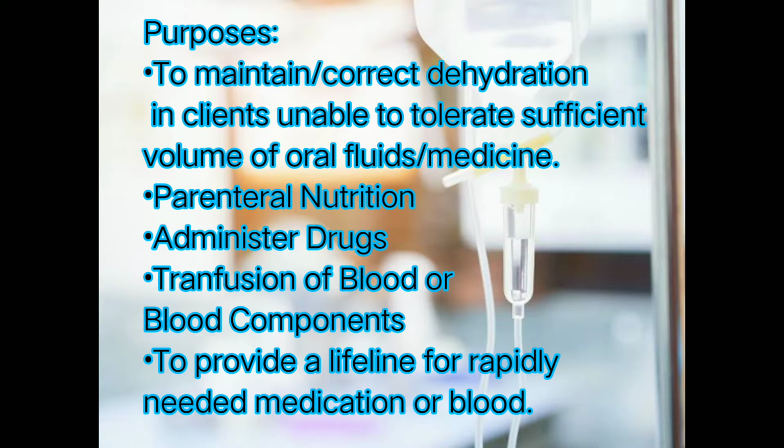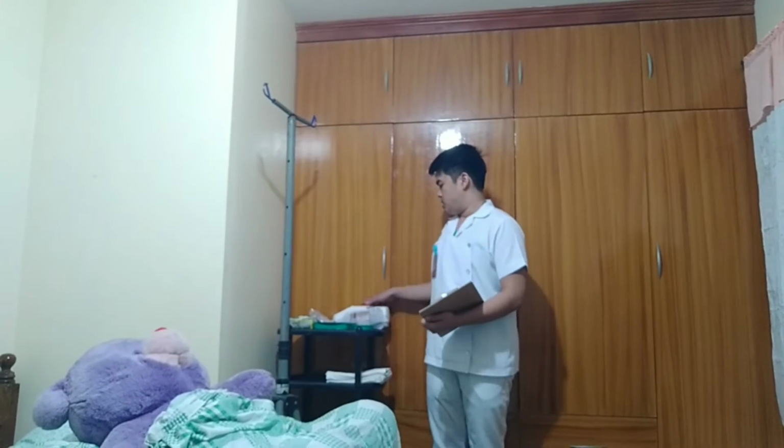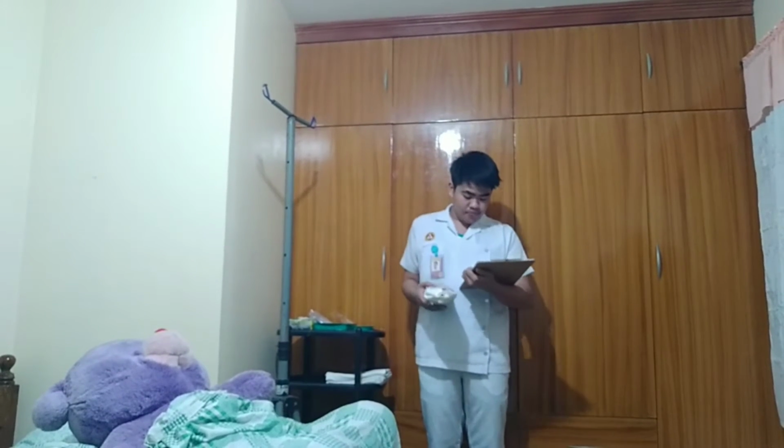medication or blood. The first thing we're going to do is check the solution and compare it to the doctor's prescription. So, for the type of the solution, the amount of the solution, the percent of the solution, and the flow rate of the solution.